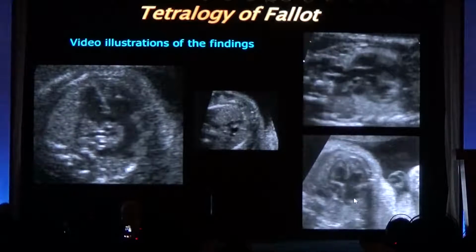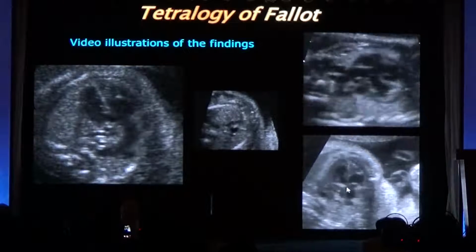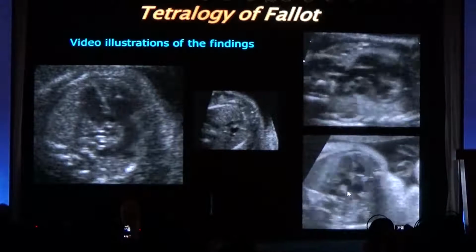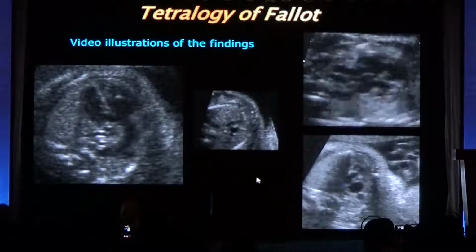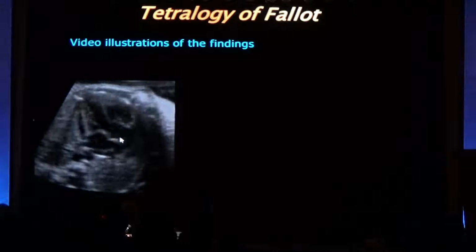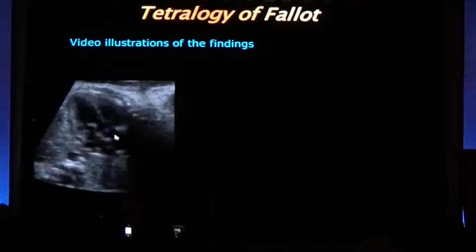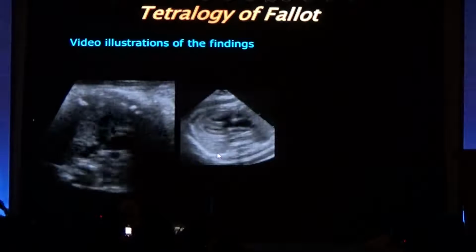Here, what do you think about the aortic valve? Is this aortic valve preventing regurgitation or not? Not at all. This aortic valve is just floating in the flow, just like a seaweed in the ocean. Okay, so this is an incompetent aortic valve. Four-chamber view looks pretty normal, just a small defect over here, and you see the ballerina leg here is abnormal. It has a kink at this level, and we have overriding of the aorta.